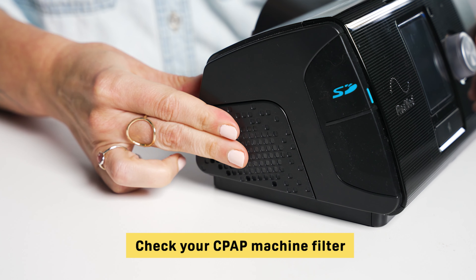One important note: if your air hose is heated, it probably contains some electrical components and will require more intensive cleaning. We recommend checking the product manual for any special cleaning and care instructions.